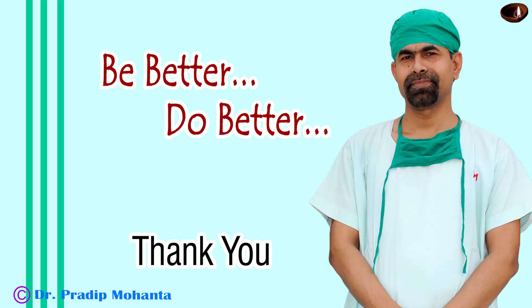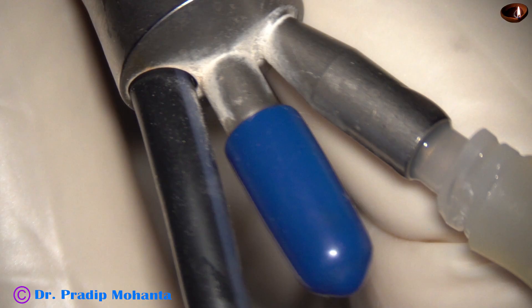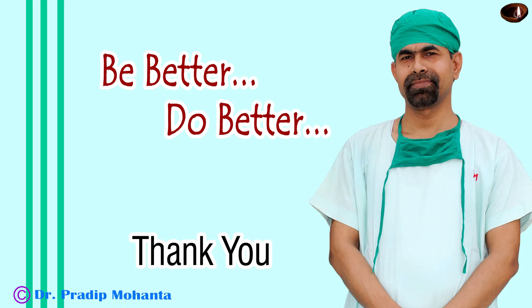Thank you very much for your attention. Hope this video will help you in understanding Hybrid Irrigation Aspiration. You can manage all cases with only one small side port using this technique. Irrigation is through the main wound by the phaco handpiece, the aspirating port is closed by a cap, and the aspirating cannula is used through the side port. Hope this will inspire you to use Hybrid IA and the Stop and Chop technique for your phacoemulsification.